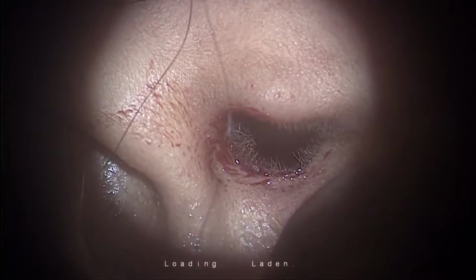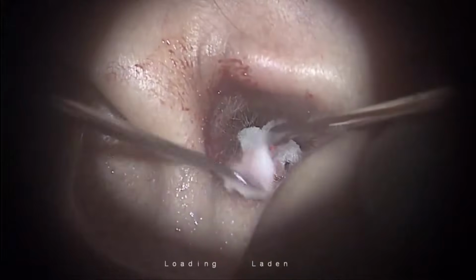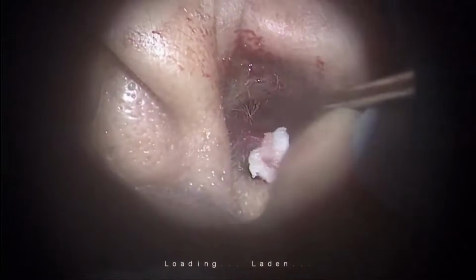Yes, sir. My associate will close the ear, he will put in the gel foam, and I am through the surgical part. So it is so quick. See, the laser makes your life simple, and this is the beauty of the luminous laser, CO2. When we made the fenestra, the footplate was thick. We used a 20-watt shot. Since it was thick, it couldn't pass through the entire thickness of the footplate. But it thinned out, and then we used the mechanical instrument to make the fenestra.